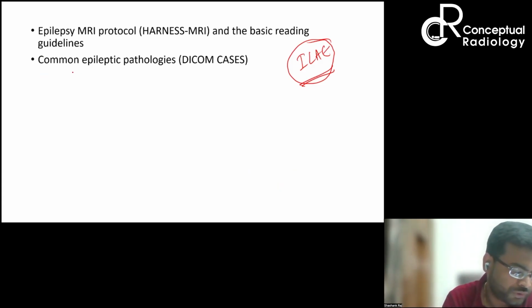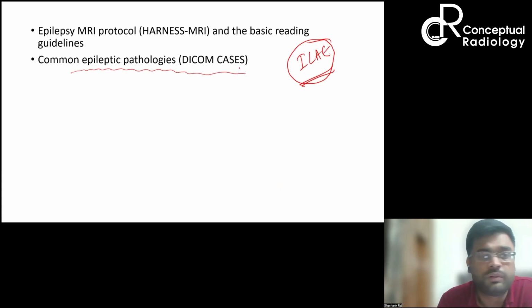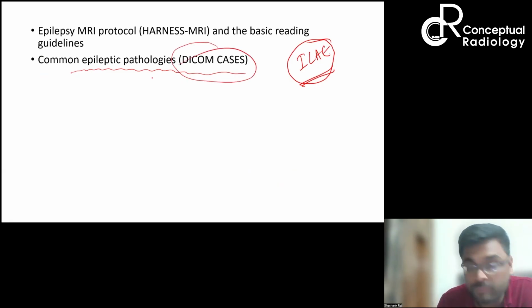And today I'm going to show you a lot of cases, around 20 to 25 cases. We are going to see DICOM cases, so it will be an interesting session. You should keep writing the answers in the chat box as we keep on seeing the cases.